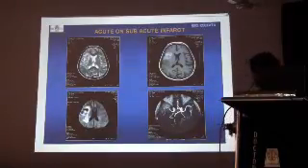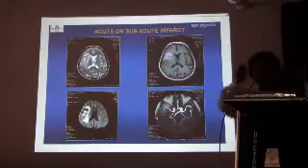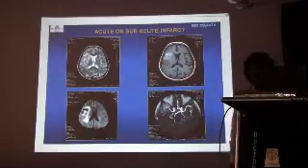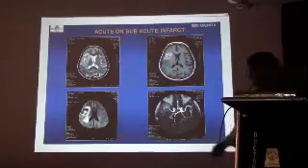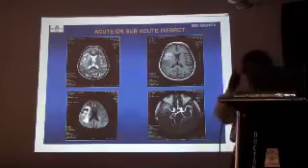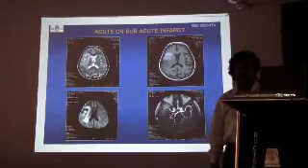Okay. And MRI angio shows this middle cerebral artery, M1, M2 segment, M3 segment, these peripheral branches are occluded. And that led to the infarction. Okay. So we take help of T1, T2, FLAIR, and MRI angio. But still, here diffusion has no much practical implication.